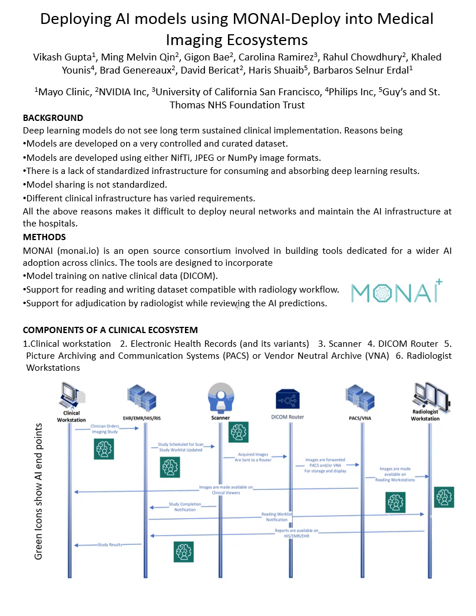This paper is about deploying AI models using the MONAI deploy framework in medical imaging ecosystems. What I mean as a medical imaging ecosystem is a clinic or a hospital and the associated infrastructure.